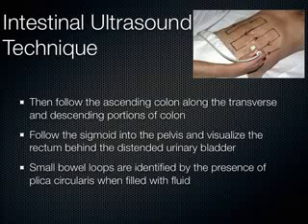When I'm doing a focused appendicitis exam, which I do quite often in the ER, I keep this mowing the lawn technique just around the right lower quadrant where the appendix is located, down there, what we call McBurney's point. Or sometimes I just hand the transducer to the patient and say, put this where the pain is. And then they start to push it on their abdominal wall, and they help to localize where I should start my search for the etiology of their pain.